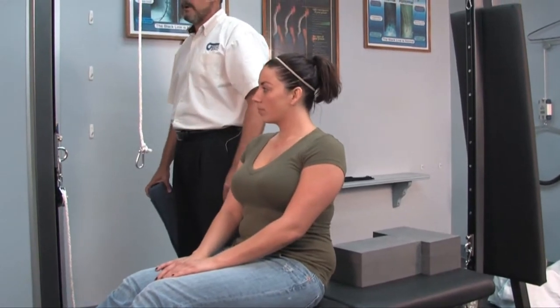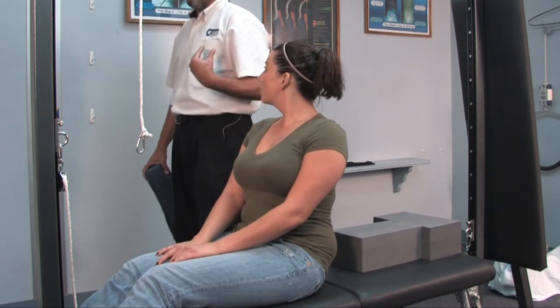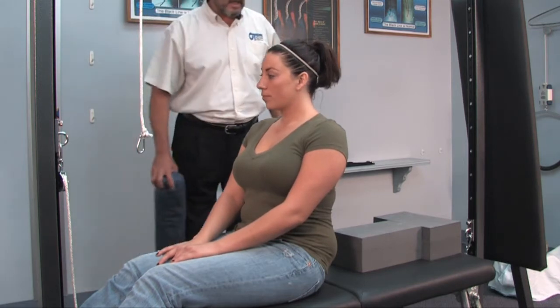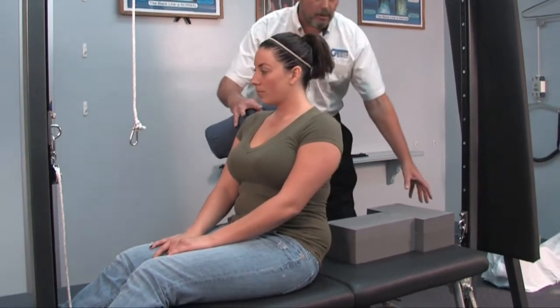The setup I'm going to show you is for a typical posterior translated thoracic posture, where we're going to pull the thoracic forward and at the same time induce curvature into the lumbar spine. We'll also set it up so that we can tilt the pelvis into an anterior flexion.